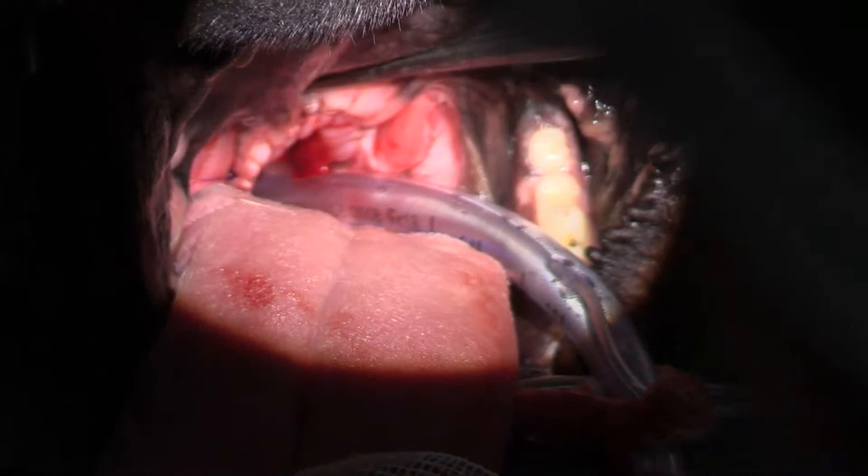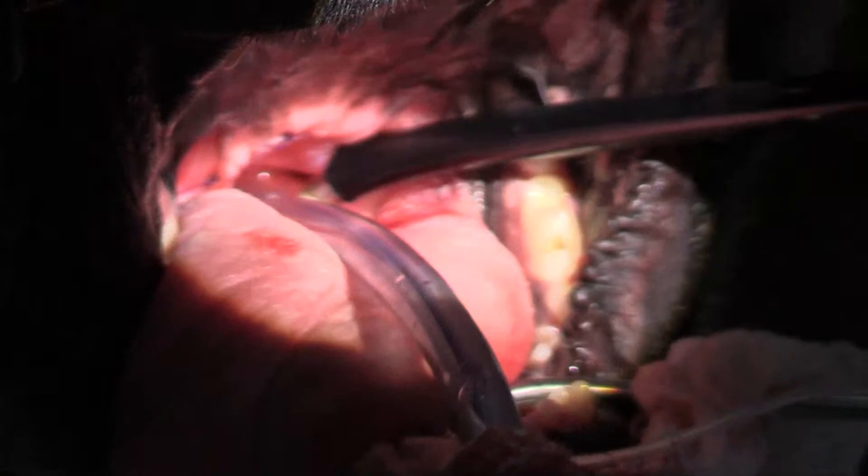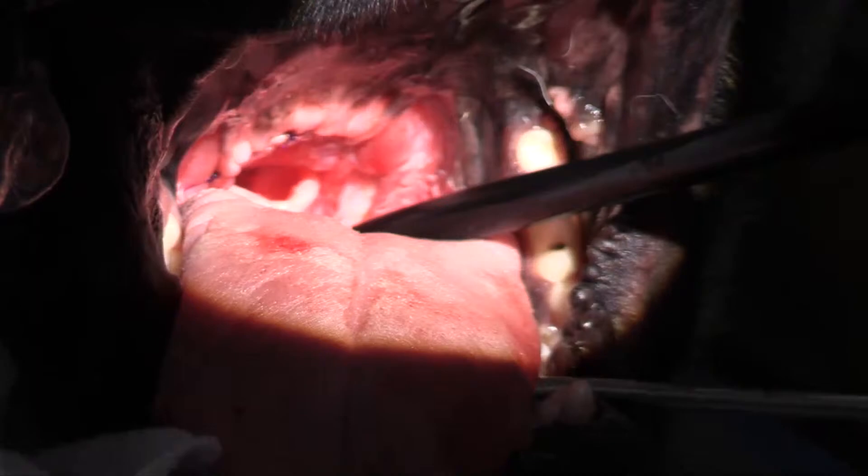That's it for the folded flap palatoplasty — I'm really happy with how that looks. I'll leave the camera on just in case you can see when I'm doing the laryngeal saccules. I do have to extubate this dog now. Regarding coblation on oncology cases, you can use it, although I wouldn't be totally confident I'm getting a completely wide margin.